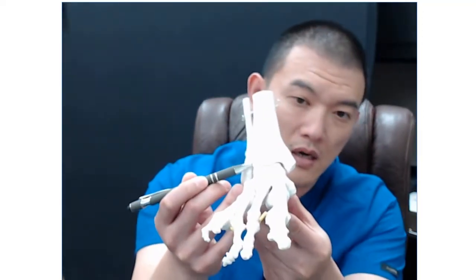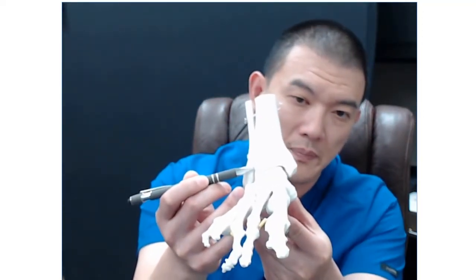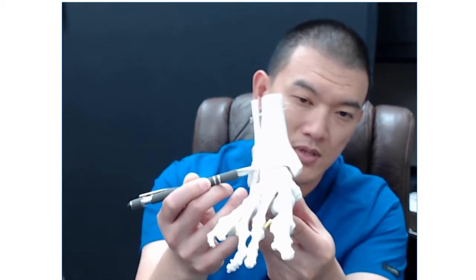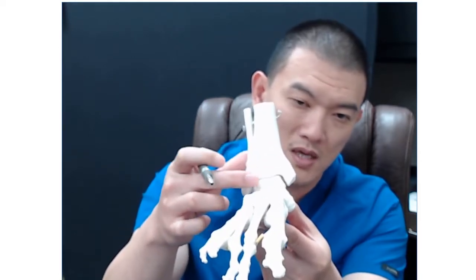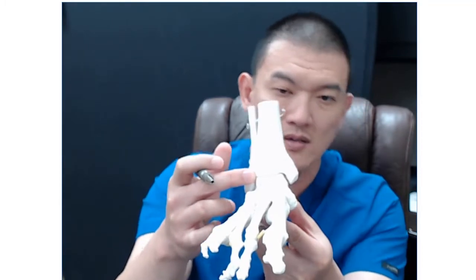One of the most common things we see in ankle arthroscopy is anterolateral impingement syndrome — this gutter right here where the fibula and the tibia come together, just a little gutter. Sometimes synovial tissue or inflamed tissue can be entrapped in there. The ankle joint capsule is a big circle right around here, like a big balloon. Anything that's loose in here is going to stay in here until somebody takes it out arthroscopically or via open surgery. Arthroscopically being the least invasive way, an experienced arthroscopic surgeon can go in and take out loose body, can take out some bone spurs in the ankle joint, et cetera.